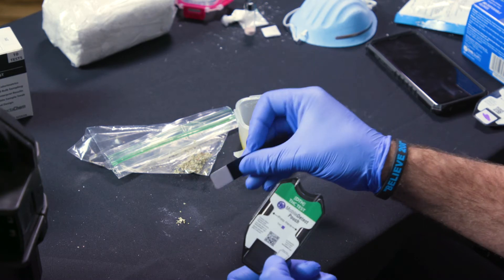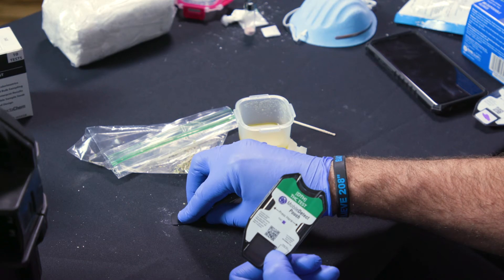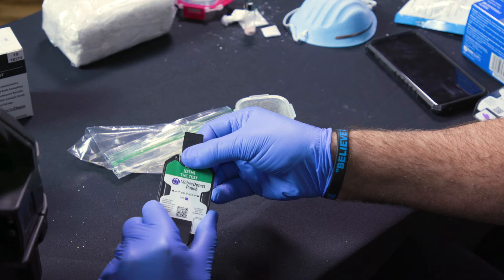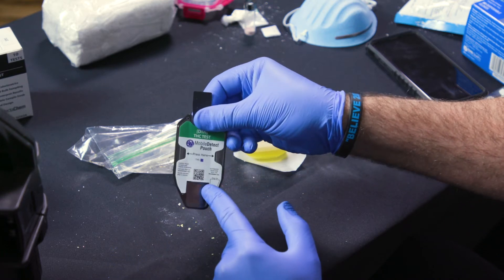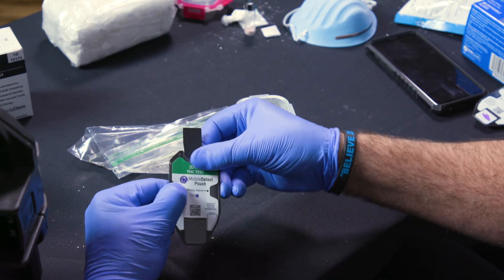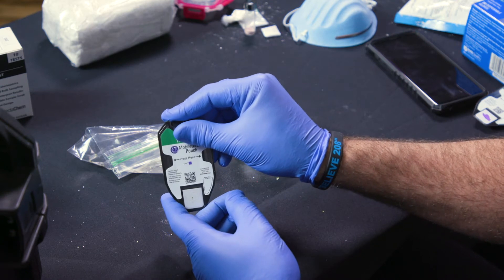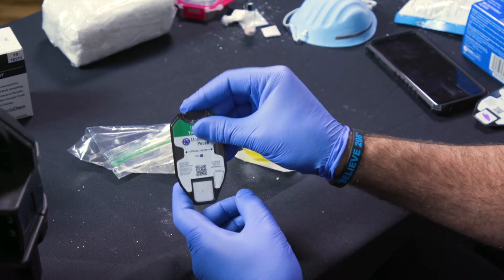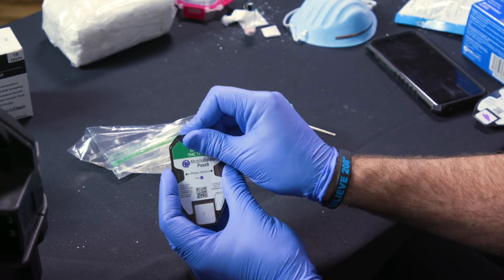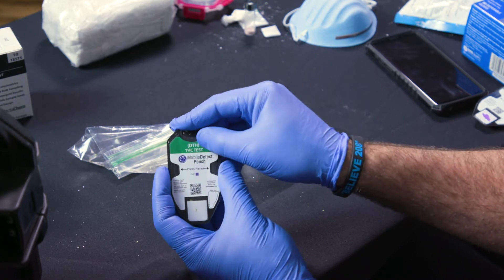Take the pouch out. You're going to want to make sure you have some of this leafy plant material on the swab. Insert it right above the gap. You're going to want to break the left ampule first. Make sure that reagent is pooled and plunge that swab. You want to make sure the whole entire swab is covered with the reagent liquid. So you might need to go up and down, move it around a little bit to make sure it's fully saturated.